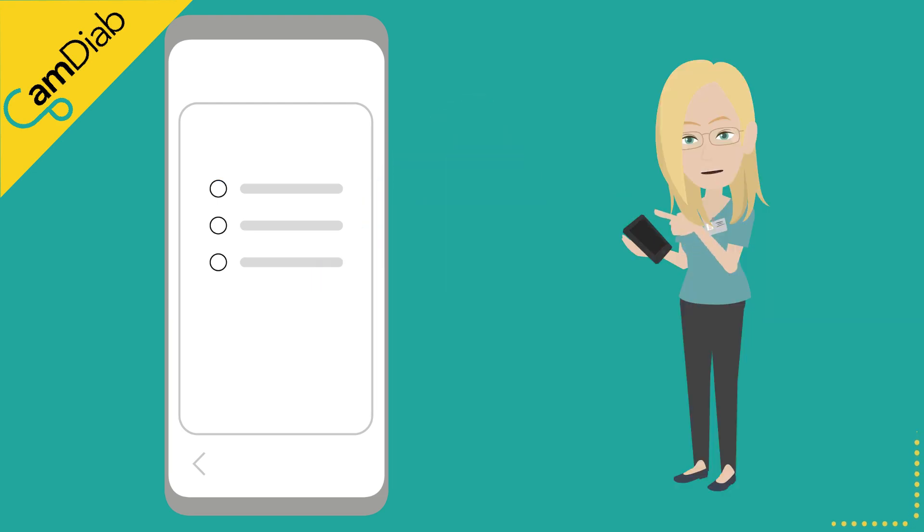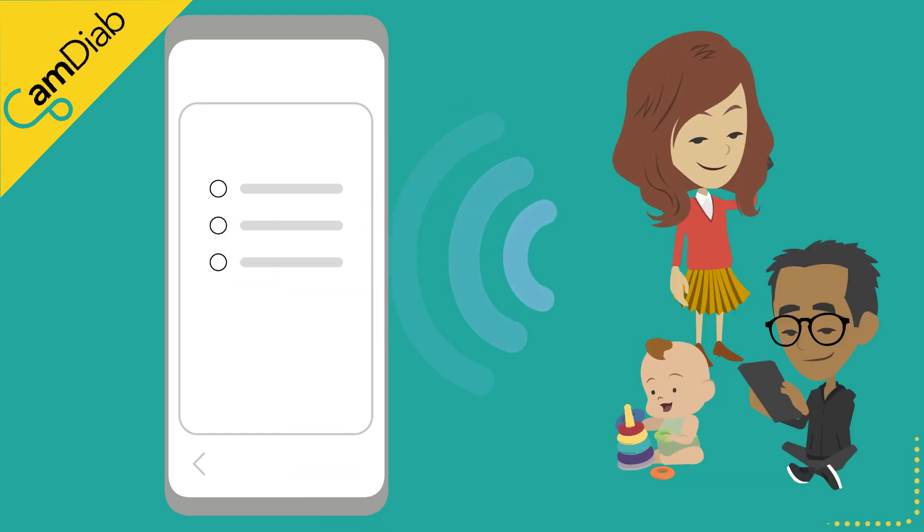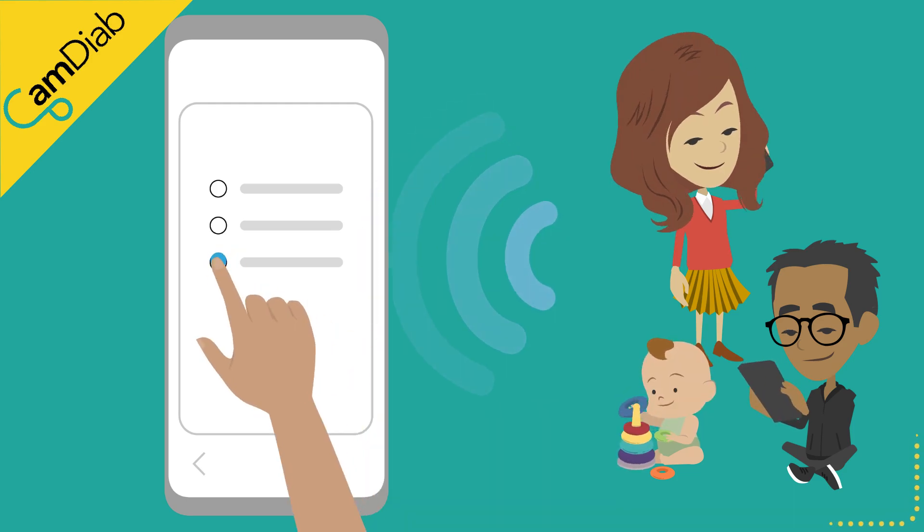If you wish to practice using the app, please select the virtual pump. If you have been invited to receive real-time insulin and glucose data from someone else with type 1 diabetes using CAM APS FX, please select companion.